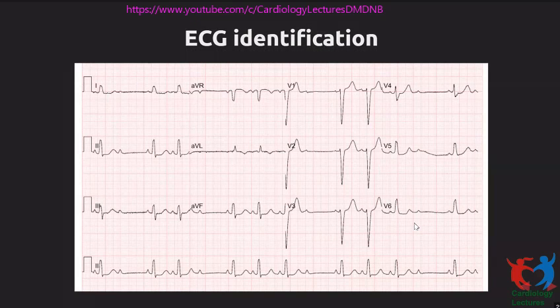Again, you have this patient where now, different from the previous ECG, you can see here there is a wide QRS, there's a left bundle morphology, and you can see the consecutive conducted PR intervals all remain constant. So there's a blocked P wave, and you can see there are 3 conducted P waves here, 2 conducted P waves here. All of these are conducted with the same PR interval.